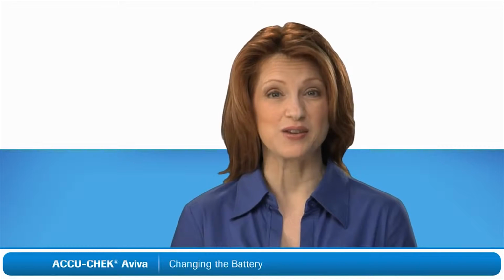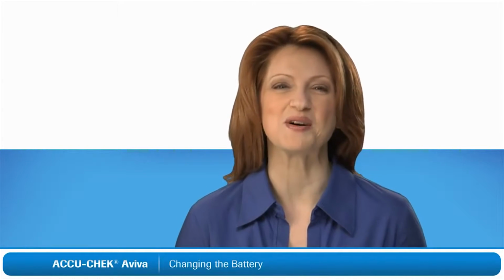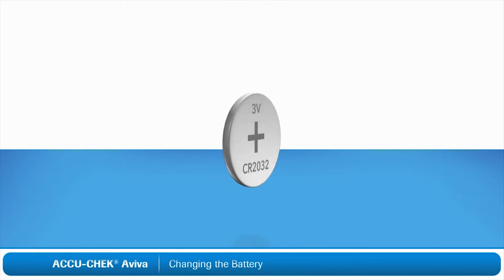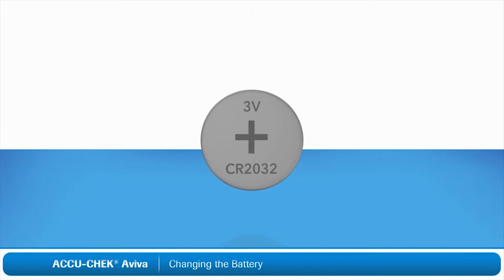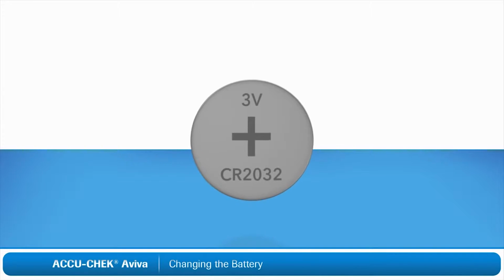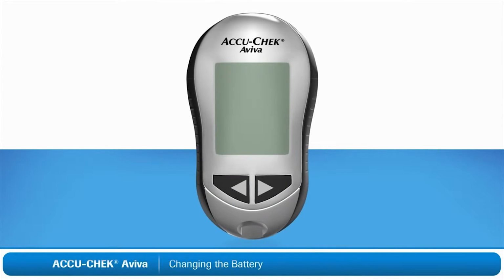Changing the battery in your ACCU-CHEK Aviva meter is easy, but if you've never done it before, I can walk you through the steps. Now, before we change the battery, you'll want to make sure you have a new battery to insert. The ACCU-CHEK Aviva meter uses one 3-volt lithium battery, which is a coin cell battery, number 2032. This type of battery can be found in many stores. It's a good idea to always keep a spare battery on hand.